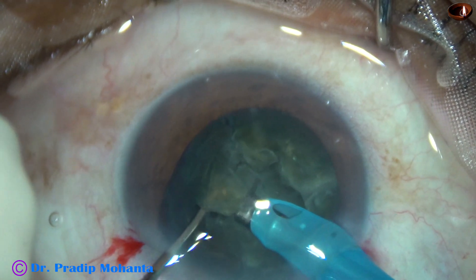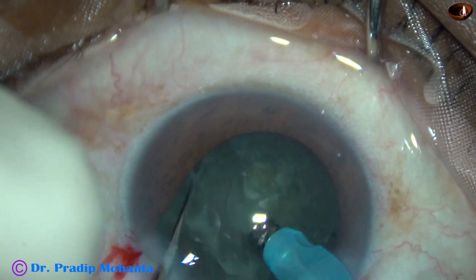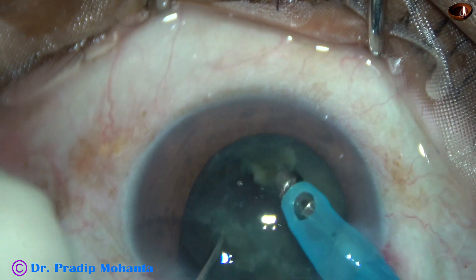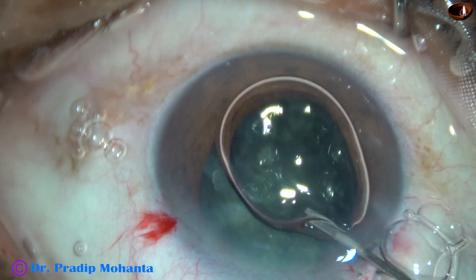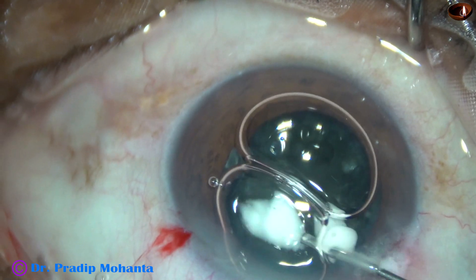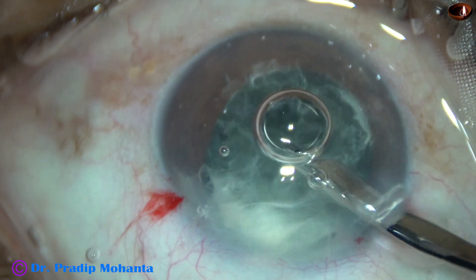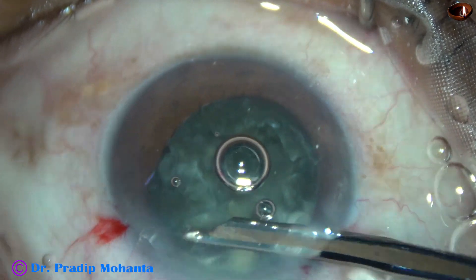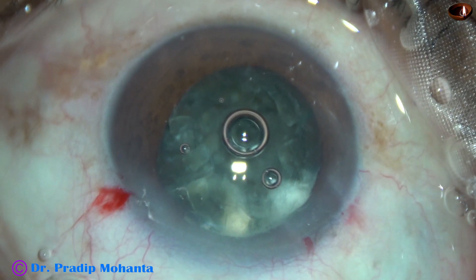But see what happens now. As I try to manage the nucleus, at one point I find that there is some prolapse of vitreous through the left side port. I could make out clearly at this time. I come out, inject air, and ask for triamcinolone acetonide. I inject triamcinolone acetonide, and as I use Simcoe and remove the triamcinolone acetonide, I find that there are vitreous strands at the left side port — a lot of vitreous strands, and some of them have come out through the left side port.